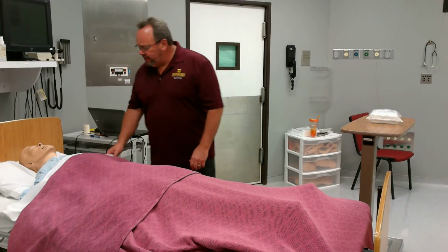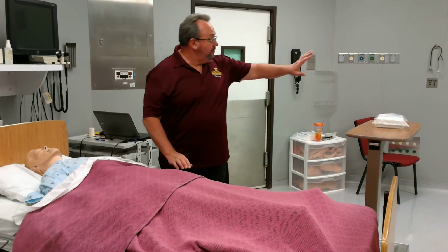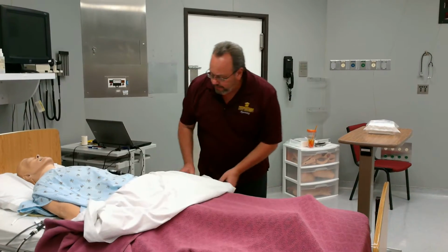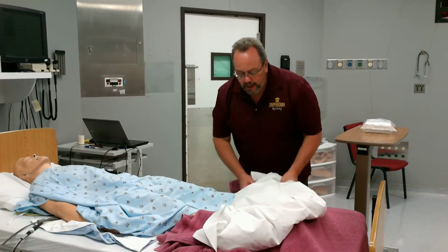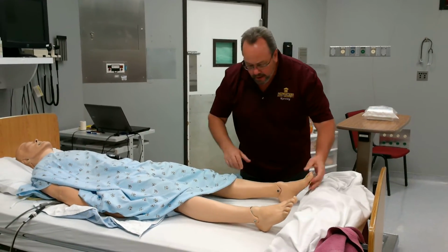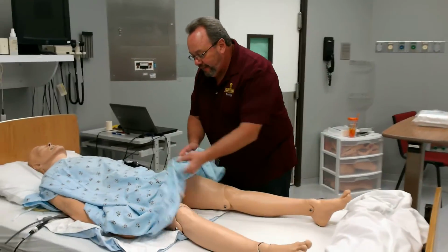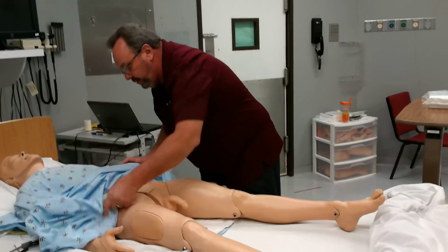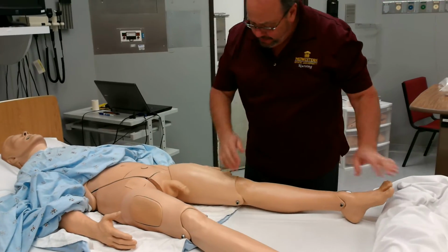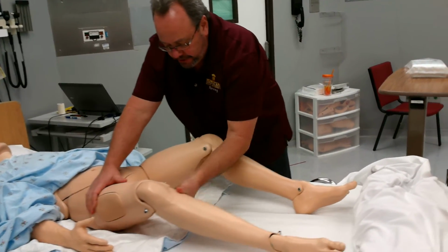I have to position you first, so I'm going to uncover you. I have provided privacy by closing the door. So I'm going to uncover all the way down to here, because I need this area for a work area. I will have to expose you, so I will expose you. And then, if possible, you get your patient to go into a frog-leg position.